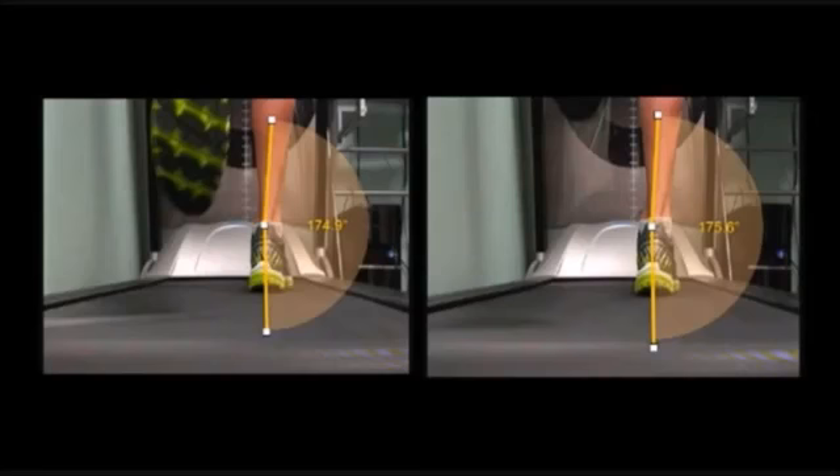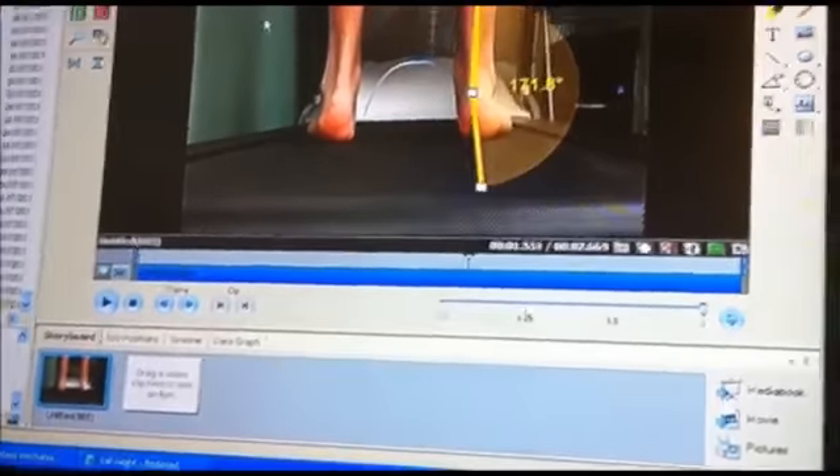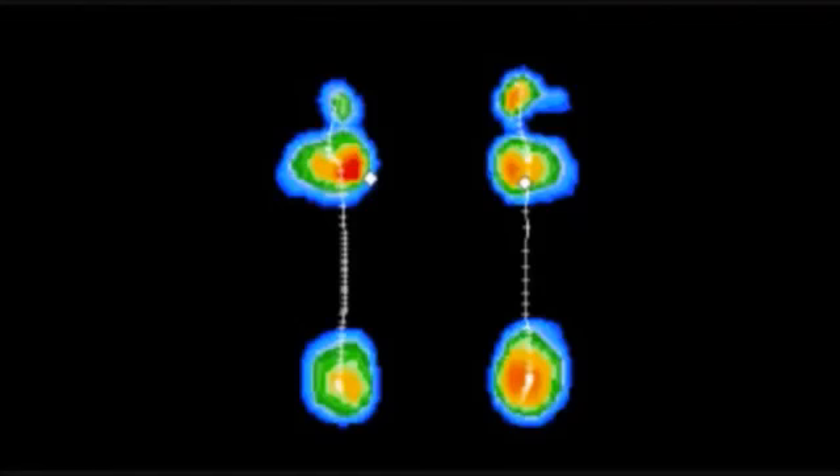Now let's take a look at a different foot type — the pronated foot. In standing, this customer is very pronated, with the right being more pronounced than the left. He is pronated around 10.6 degrees when the normal we would be looking for is around 4 degrees. From the pressure scan, you can see high medial and lateral loading and increased pressure towards the medial forefoot. The centre of pressure also deviates medially late.